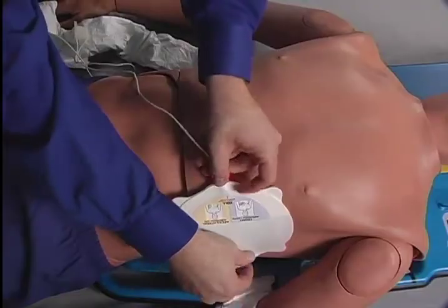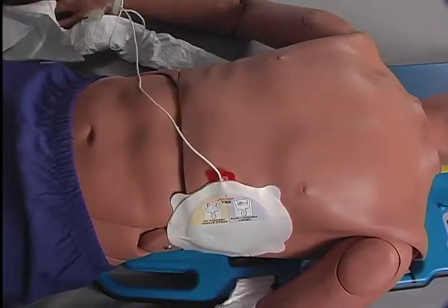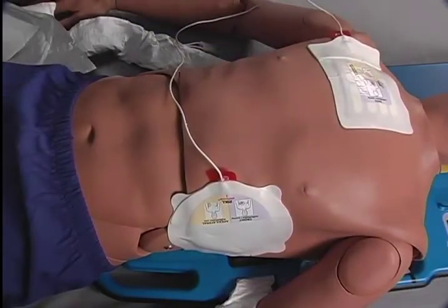Alternatively, the board may be placed to the patient's side and the patient may be log-rolled onto it. The shirt may be cut up the front midline and up the right arm and then removed during the log roll. Once the patient is properly placed on the board, apply the front defibrillation pad if local protocol is anterior-posterior placement, or both pads if apex sternum is the preferred method.